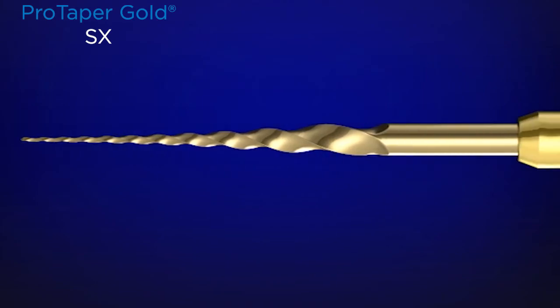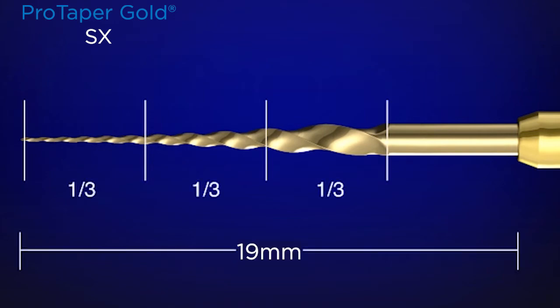Taking a closer look, along the active portion we can divide the instrument into thirds. It's only 19 millimeters long from the D0, or tip of the instrument, to where the shaft meets the handle. The last third — the more distal third — is really not to cut. It's to follow along the glide path that you've either secured or that already exists.